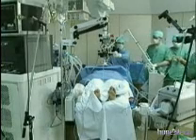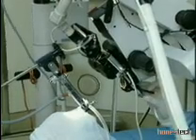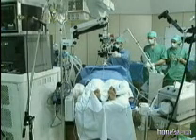We demonstrate the AccuBlade, a new advanced CO2 laser system for improving microdissection. The AccuSpot micromanipulator, attached to the operating microscope and connected to the laser arm, yields the smallest possible beam diameter of 250 microns for a focal length of 400 millimeters. The AccuSpot has rendered phono-microsurgery precise and risk-free in terms of thermal damage, though the edges of the incision appeared slightly dented.